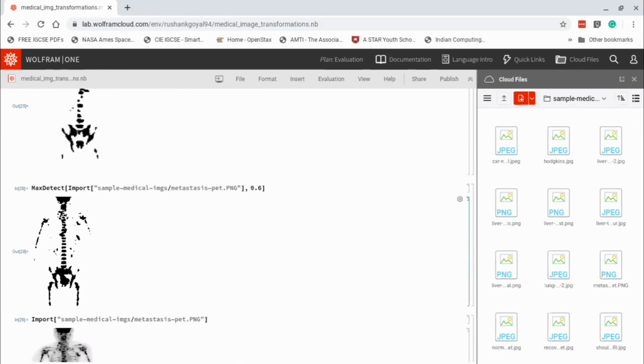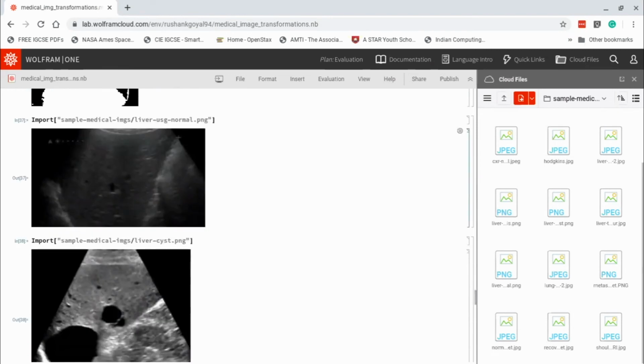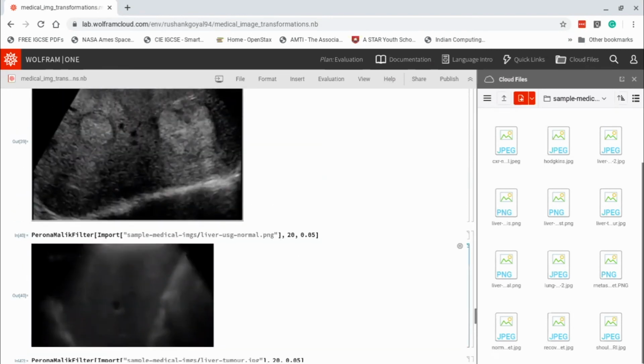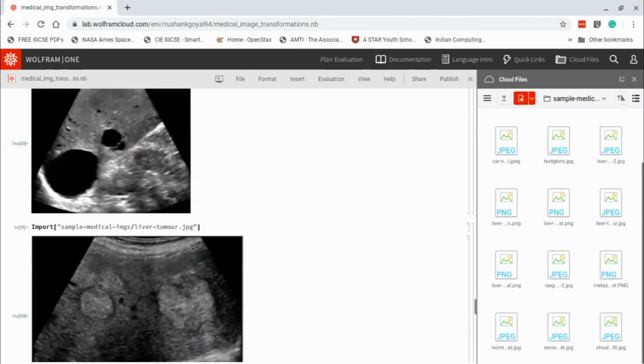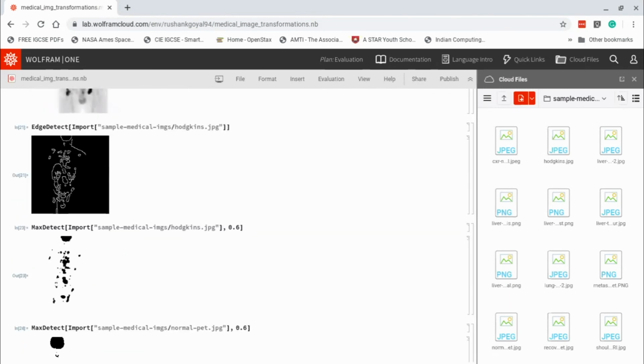Okay. There are a couple of chat questions. Should we have a look? Sure. So one of the first ones is: what is the difference between a threshold and the max detect function? Can you talk about that? Threshold functions, we didn't really use the threshold function.